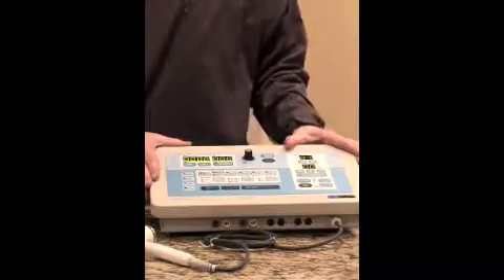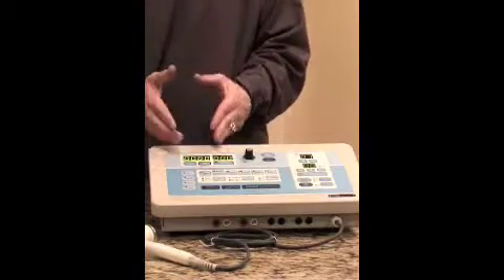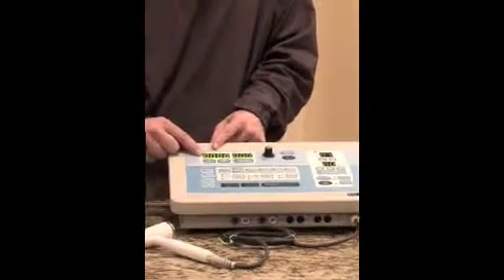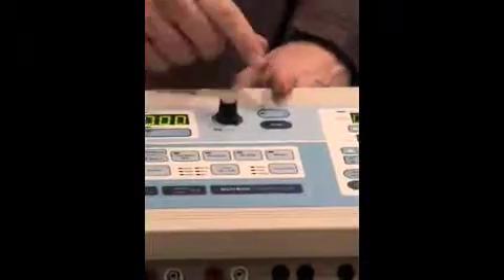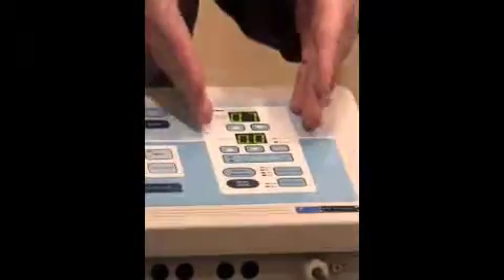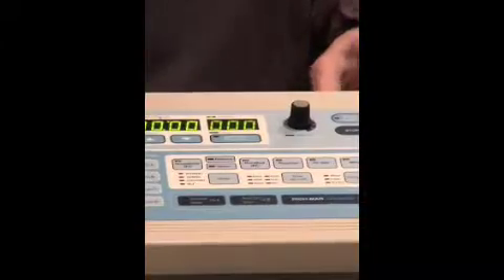Let me tell you a little bit about what each of the buttons do. Up here at the top we have our time and our intensity — these are digital windows that allow you to see those values. Over here in the middle section we have an intensity knob and two buttons: start and stop. Over here is going to be our ultrasound area, and the bottom of the machine is our stim area. It's a fairly easy unit to operate and control.